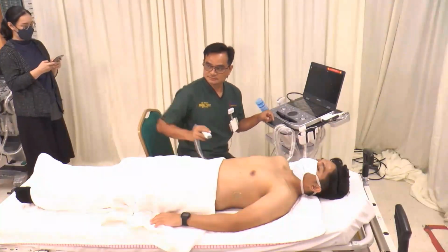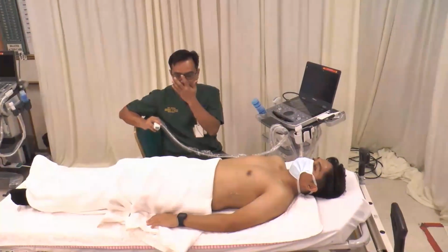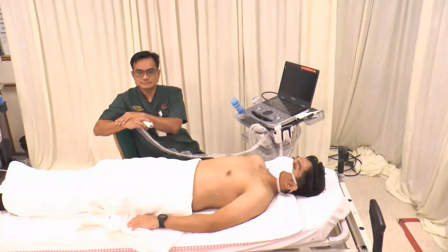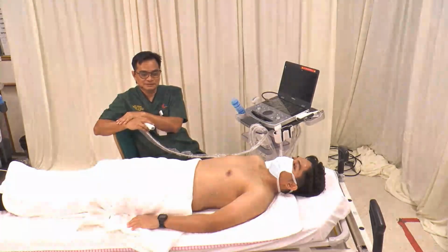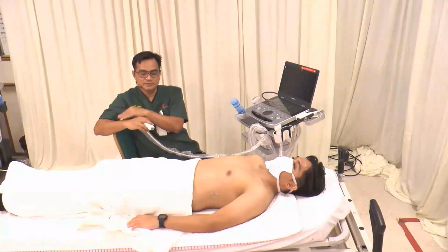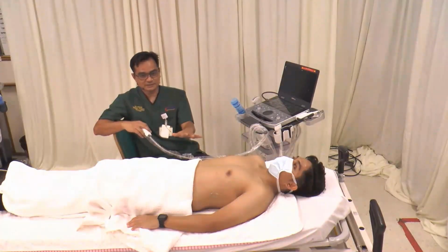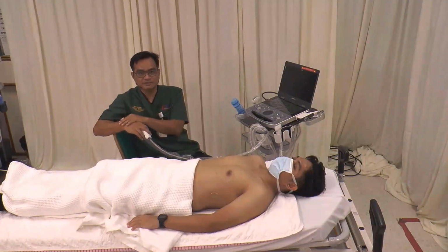Yes, thank you, Adi. There is one question from a doctor from Vietnam. I think the question is, what would be your tip in the face of COVID-19 to monitor fluid responsiveness? One thing we found in COVID-19, the parameters to look, assess, and monitor the intravascular volume is the same as any septic shock. So your IVC variation is good, right? Your VTI is also good.